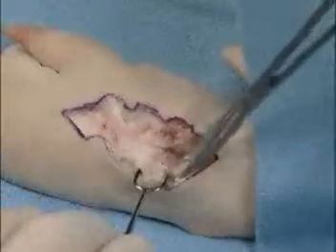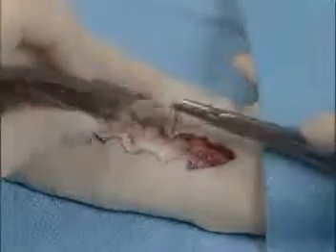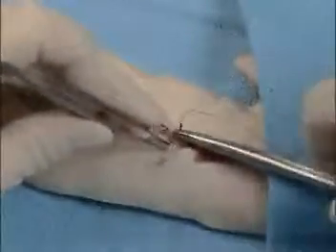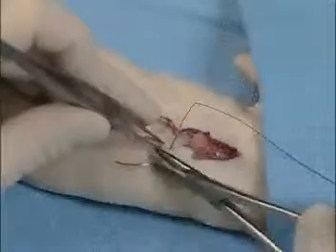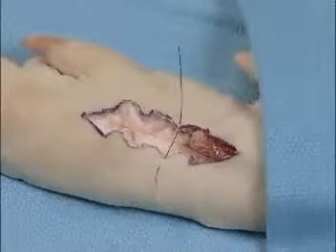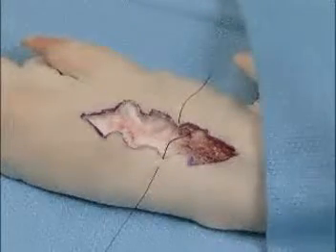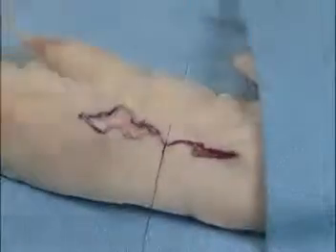Once these tissues are well mobilized, then the surgeon will try to close the tissue by pushing the tissue together. Deep sutures can be utilized if necessary. There he's trying to close the tissues, and you can see we're now placing the sutures from apex, from peak to valley, and the tissues being well undermined allows the closure to occur with minimal tension. You want to close it with minimal tension to prevent widening of the scar postoperatively.